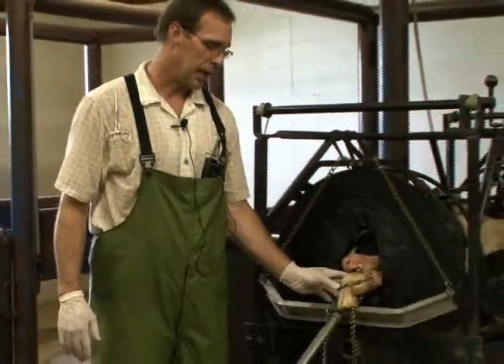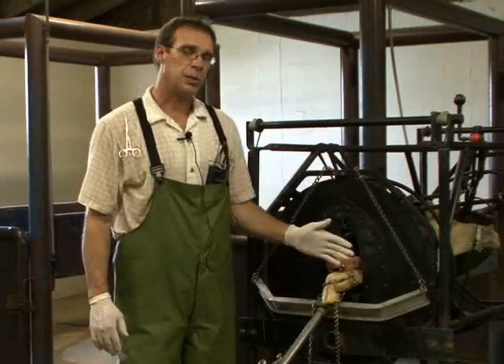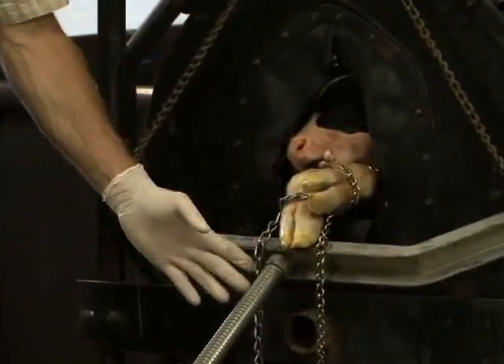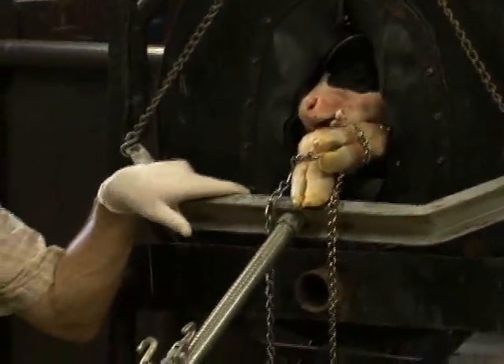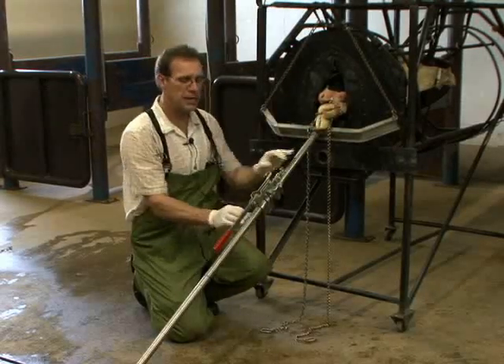If we're correcting a dystocia in a cow, and we've already determined that the calf is in the correct presentation, position, and posture, and we've placed the chains on the calf's legs to help facilitate delivery, sometimes we need assistance to forcefully take this calf from the cow per vagina. We can use several different people to apply traction on the chain, but sometimes we need more than just several people. So what we have available is a calf jack, which helps provide a lot of force to deliver a very difficult parturition, especially where there is a space-related problem.